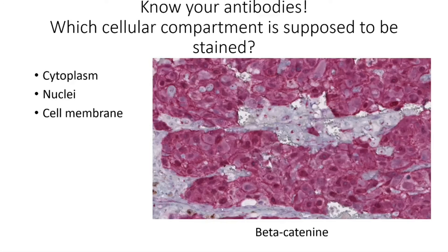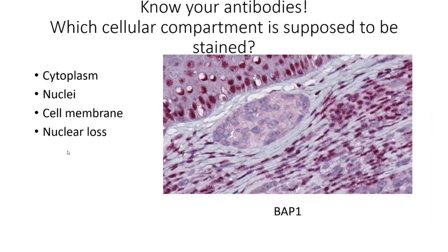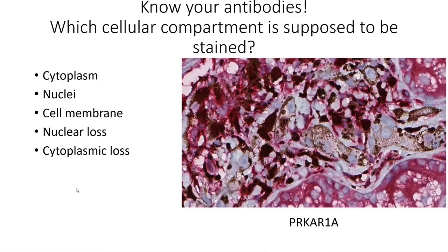The cell membrane, the nuclei, and the cytoplasm can all three be involved in this beta-catenin stain. Sometimes you will be looking for a nuclear loss — for example, for BAP1 here in this nest. All the nuclei have lost BAP1 expression, with controls of course here in the epidermis. Another expression pattern is cytoplasmic loss: you're going to look for PRKAR1-alpha loss, which is quite specific of pigmented epithelioid melanocytomas.